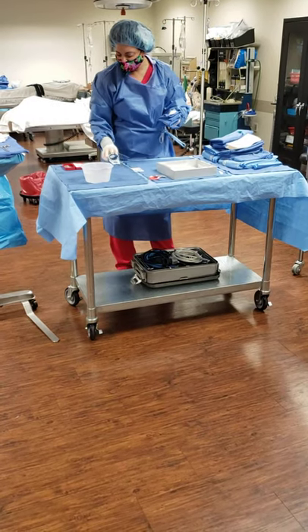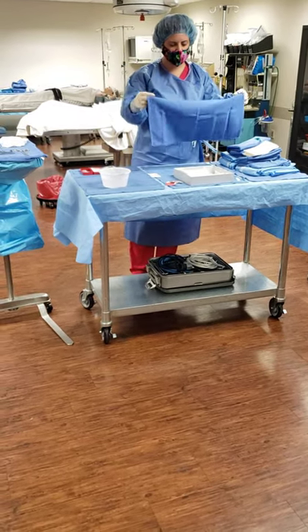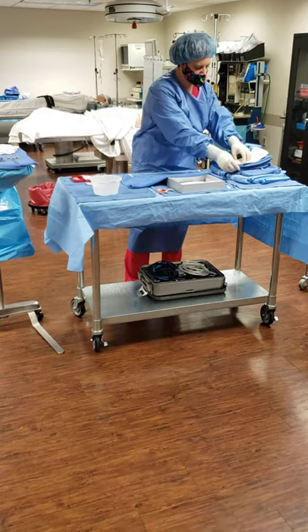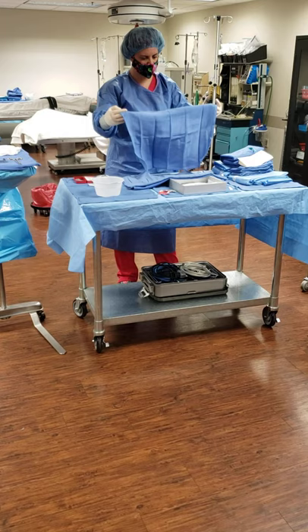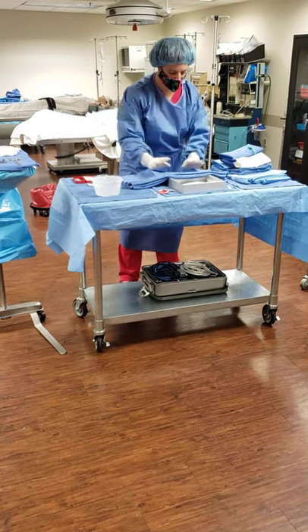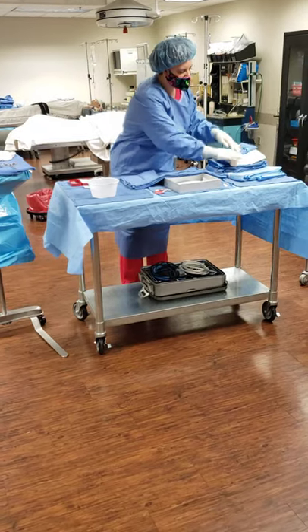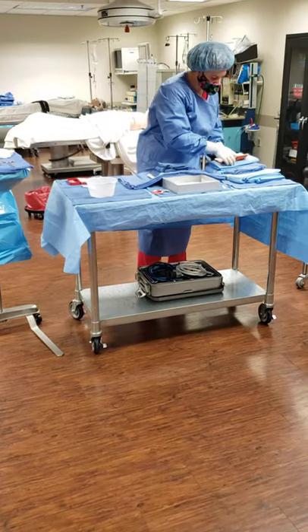Now the last thing we have to do is make our drape towels — our four-square towels. The way that I fold them is just a two or three inch little cuff. I'm going to do three of them where I'm cuffing them towards me, and then the last one away. They're perfectly set up so when my surgeon gets ready to drape, the bottom one is what she's going to want. I'm going to need her gloves, her gown, and she gets a good towel.